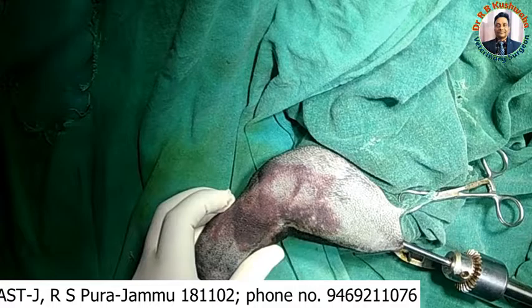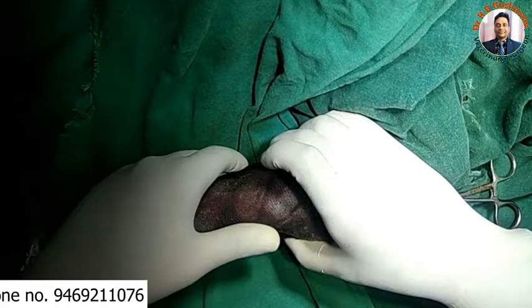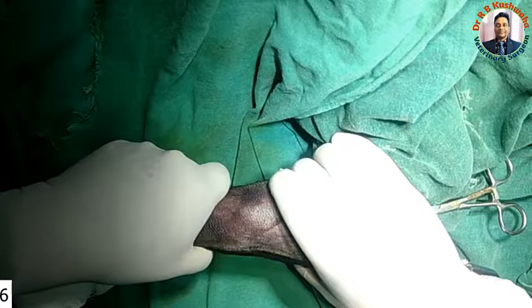Now I felt the tip of the pin — it means the pin has gone into the proximal fracture fragment correctly. Now I will try to reduce the distal segment.